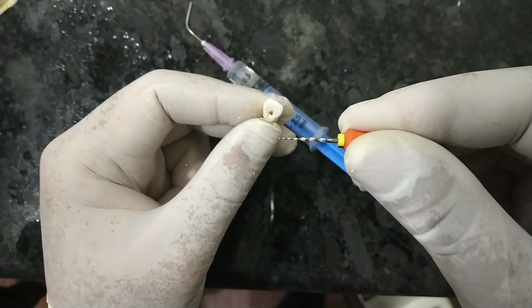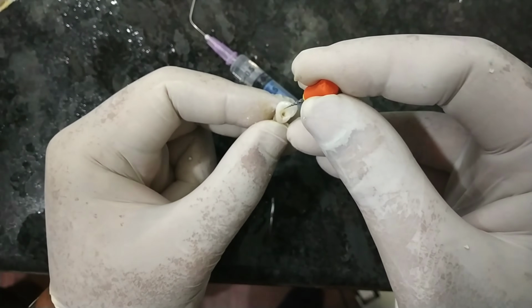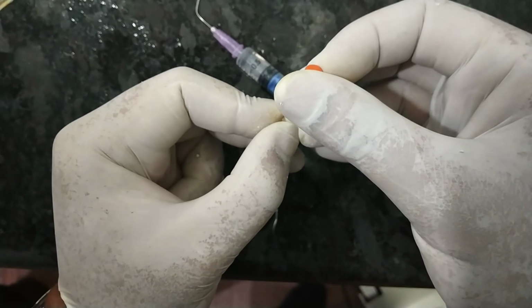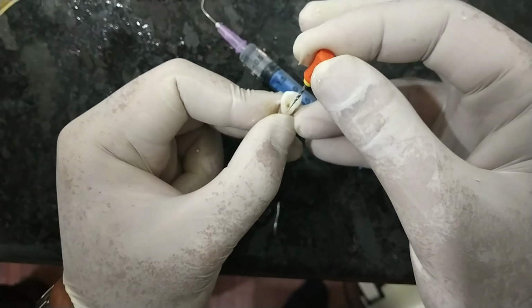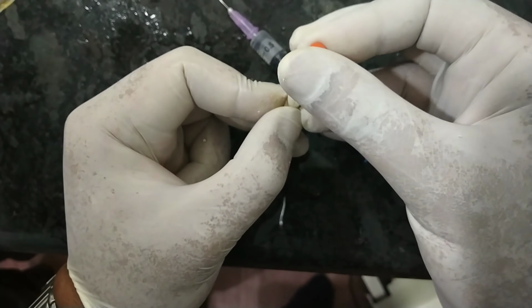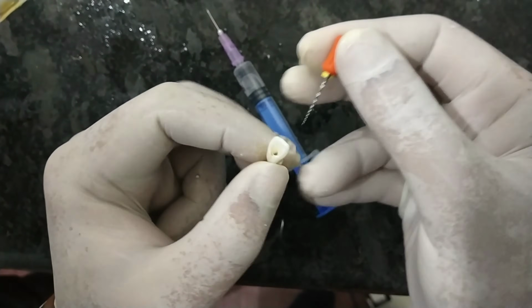And now I am using the SX Protaper file, which is just to enlarge the opening of the canal. You just have to insert it like this inside the tooth and rotate it 3/4 and then reverse rotation and then pull. So this is the motion of using the Protaper SX file. You should not use it in more than 5 to 6 cases. Otherwise, your SX files may break.